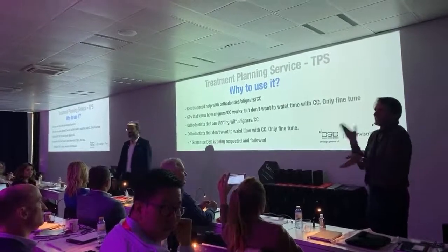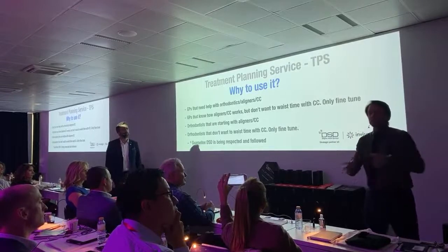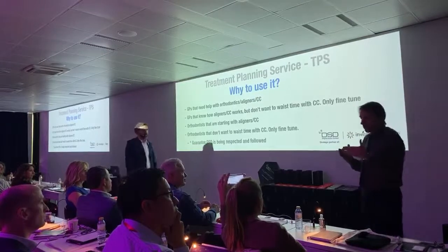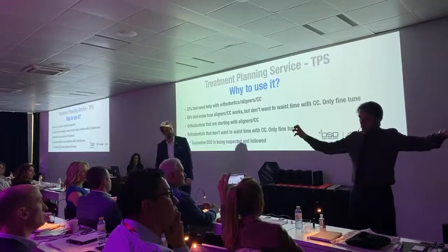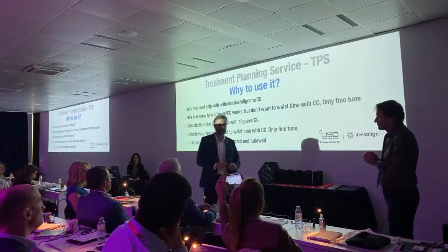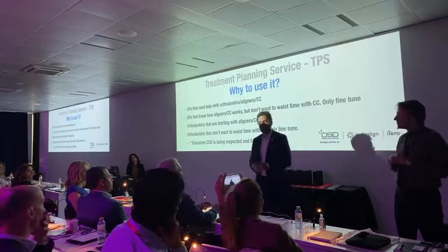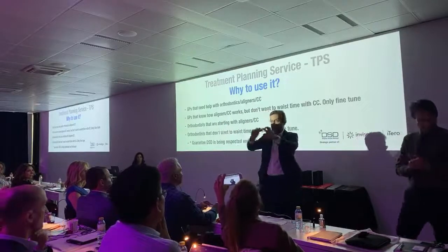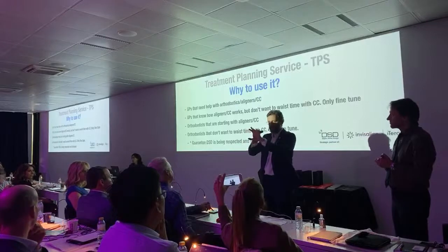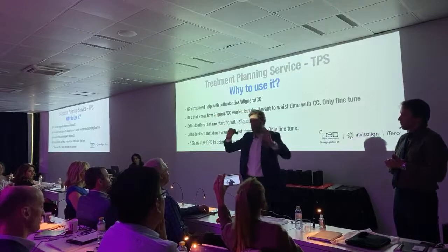Now, what does TPS mean inside DSD? We found out that TPS would be the solution for the DSD Invisalign workflow that was kind of clunky, because we were working on Nemotec software, and Costa Rica in the ClinCheck software, and things were not overlapping. We have never been able to see what Costa Rica was sending to you, not even if our design was respected, the alignment was the same, the original model and our design, if this alignment was good.